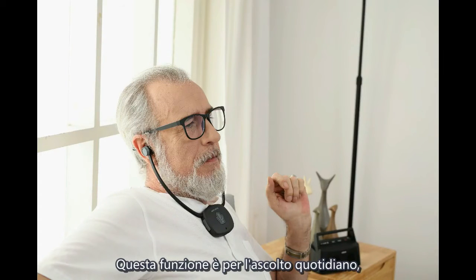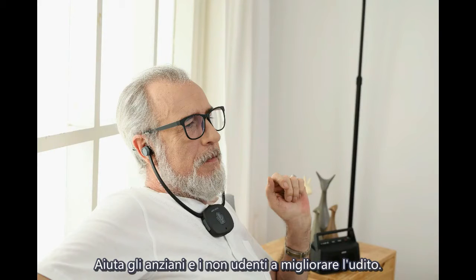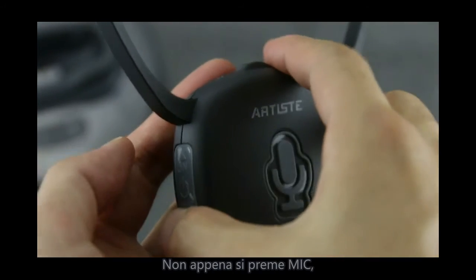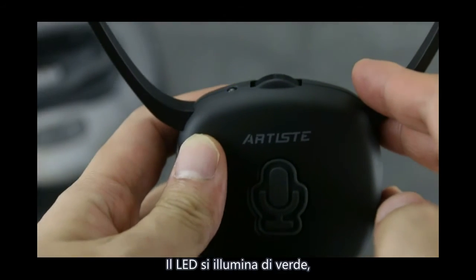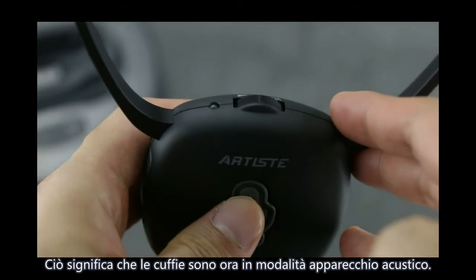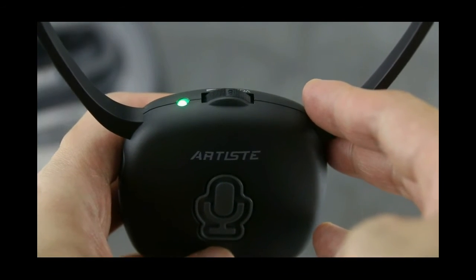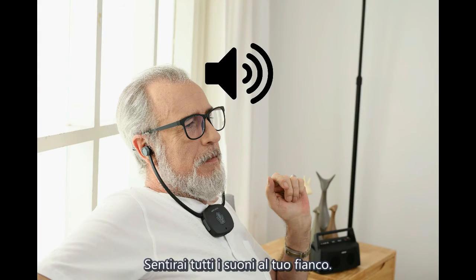Hearing aid mode. This function is for daily hearing and helps the elderly and hearing impaired improve their hearing. In this mode, you don't need to connect with the transmitter. Turn on the headphone and press the microphone once — the LED turns to green, indicating the headphone is in hearing aid mode. Wear it and you will hear all sounds around you.